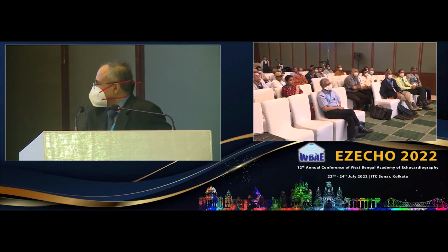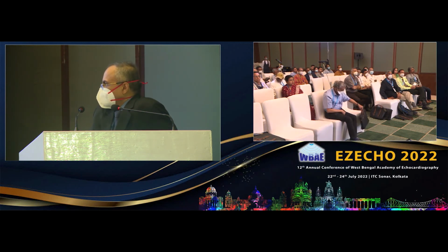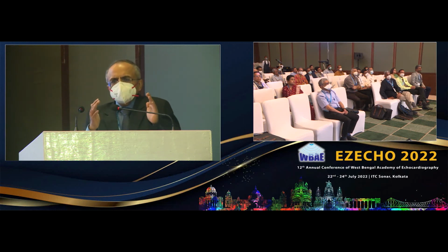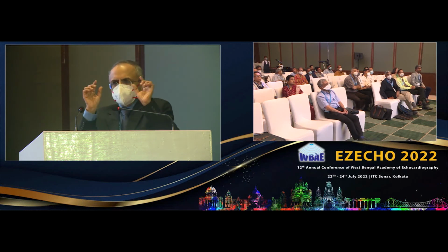Actually, I have gone through an article on this group of patients, septal convexity. Septal convexity is very important to differentiate the athletic heart from HCM. From the midline, if it is more than 7.5, then these are features of HCM. Convexity towards the cavity, correct. So this is a very interesting observation, because obviously the hypertrophy is going to happen at the expense of cavity. So generally they will be convex towards the center of the cavity, while the hearts which are enlarged because of the training will expand, the diameters will increase, the thickness is increased, but they will not be convex towards the cavity.